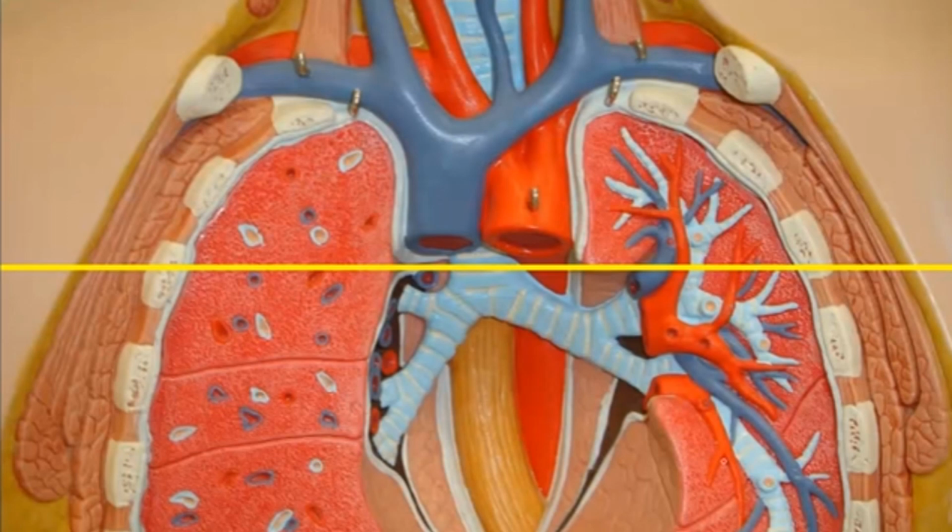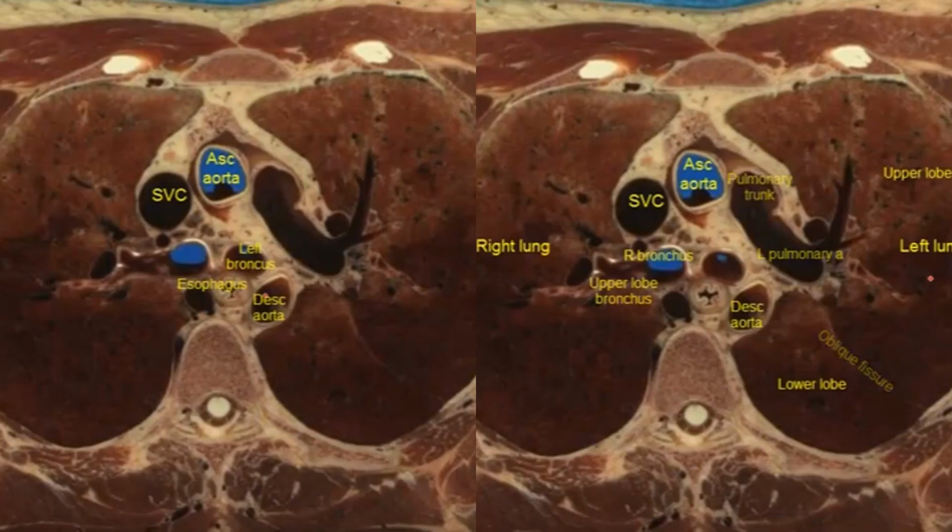Right, and so this is where we're getting closer. Notice on there, we had one giant hole in the middle there, and that's looking at the carina. That's right there. And so we're getting closer and closer to the carina where we'll split into the left and the right lung. We've seen the aortic arch a lot more prominent here, so we're just moving on down.